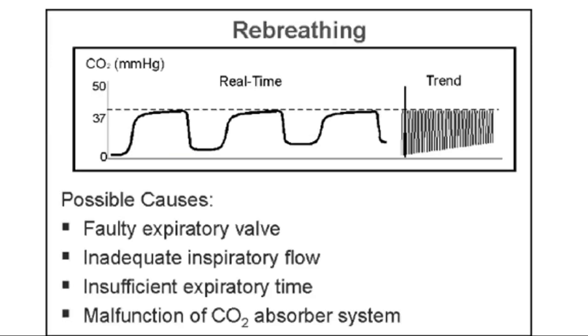Well, what you have here is air trapping of CO2 in your respiratory circuit. So most likely, your one-way valve, either on your vent or BVM, is not allowing complete exhalation of CO2, and you're rebreathing it. This also can be a sign of air trapping in the lower airways, and this always requires prompt, immediate attention to make sure you're not stacking breaths and about to blow a lung. But you need to figure out what's going on.